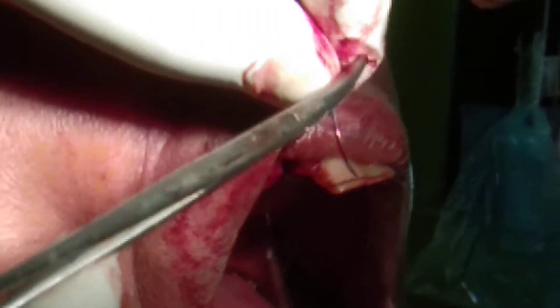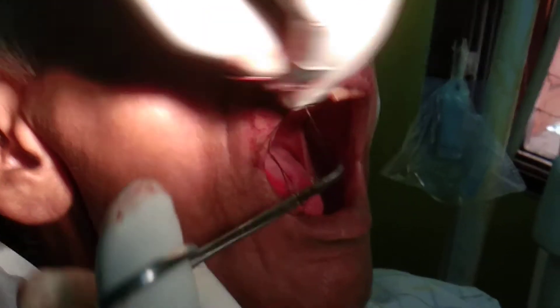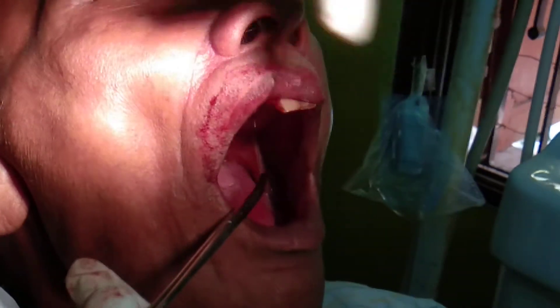Look at the way I am holding the forceps — this is the way of holding the forceps. Unlike other surgical practices, here you don't have much opportunity to rotate your hand. So here all the surgical activities are wrist work. This is called a surgeon's knot.